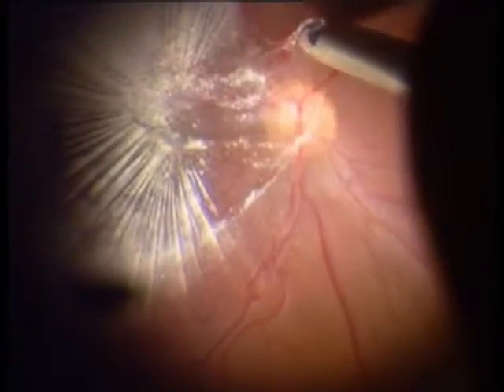After this, we peel the hyaloid. As you would see now, the whole wave of the hyaloid is created, and the residual is removed.